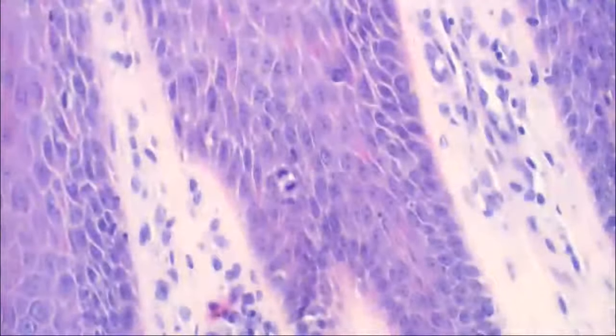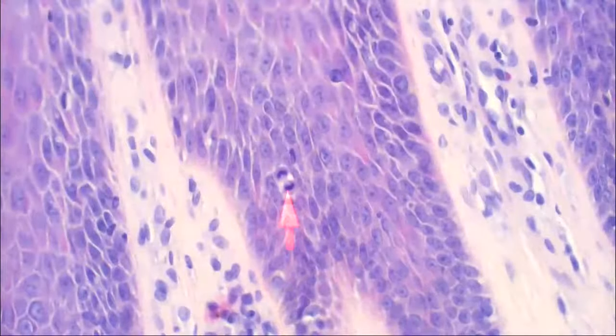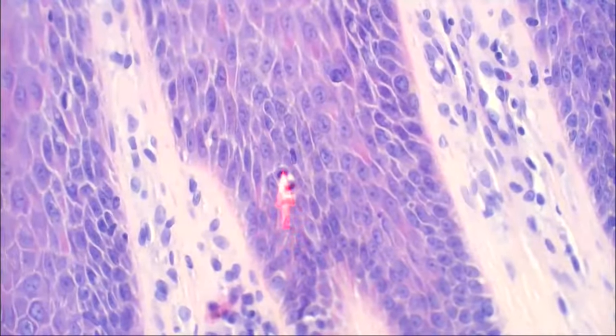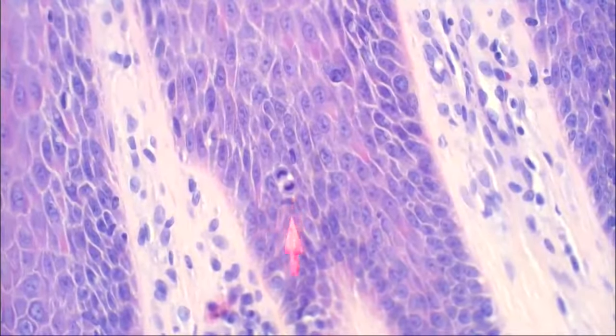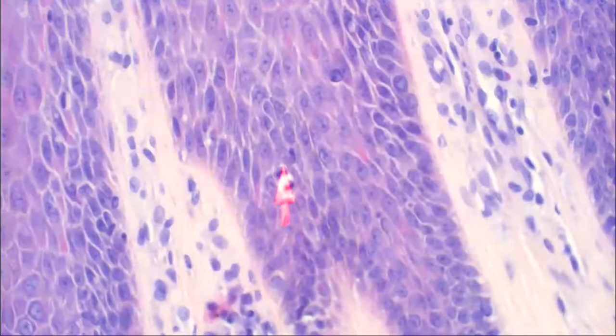What am I showing here? What finding is this? Mitotic. Is that a normal location for a mitotic figure in the epidermis? It should be in the basal layer. Yeah, suprabasilar mitoses. So that's a sign of psoriasis also.